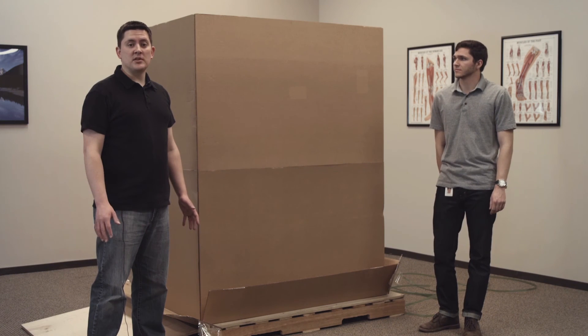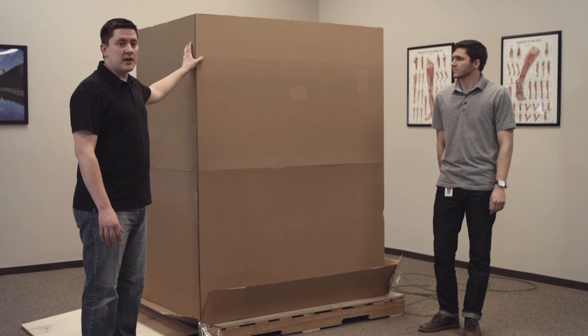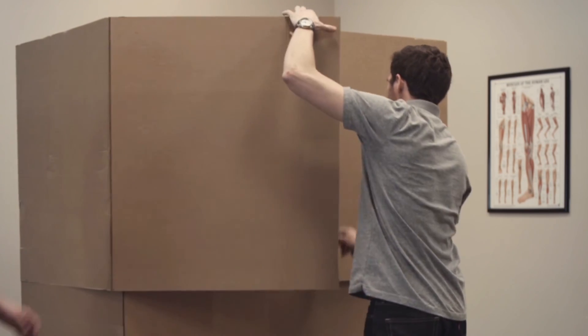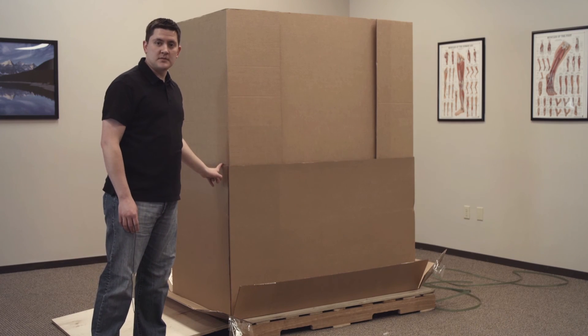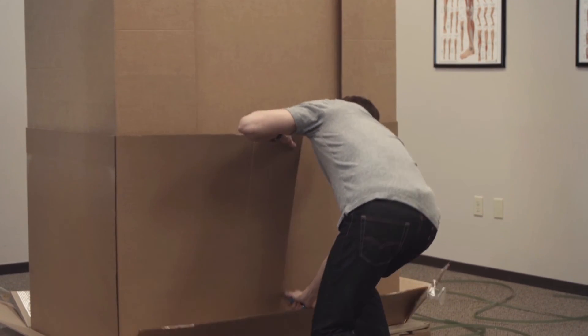The next step is to remove this outer layer of cardboard. We're just going to make a cut all the way from the top down to the middle where the first split is. There are two pieces, so we've got to remove the bottom one as well — I'm going to make a cut down the middle from the top to the bottom.